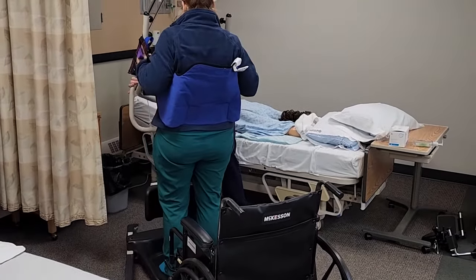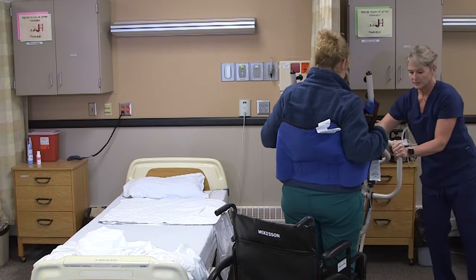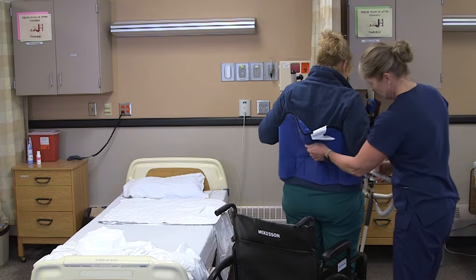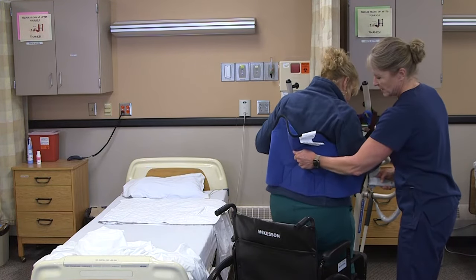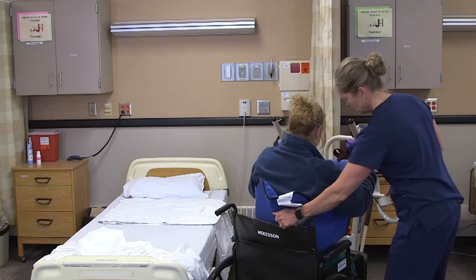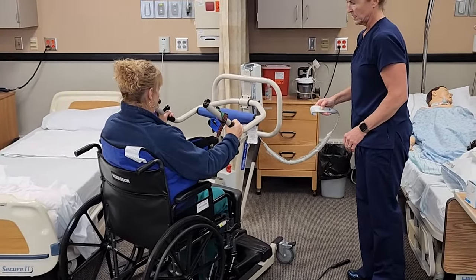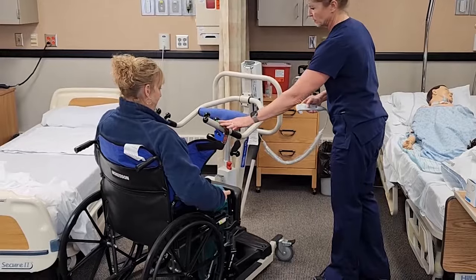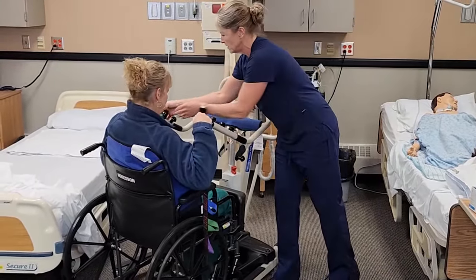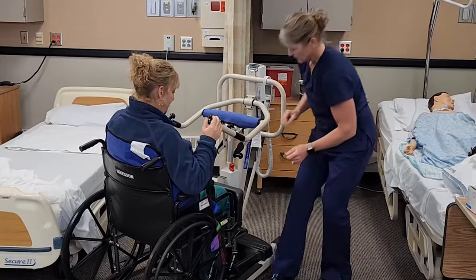We're going to move her slowly back into the chair. Are your knees touching the back of the wheelchair? With the remote, if I need to, I can grab the back of the sling and bring her down so her back gets all the way back into the wheelchair. We're going to bring the lift down until there's no more tension. Are you sitting okay? And we're going to unbuckle. If there were a bottom buckle, we'd make sure to unbuckle that before we move the lift away.